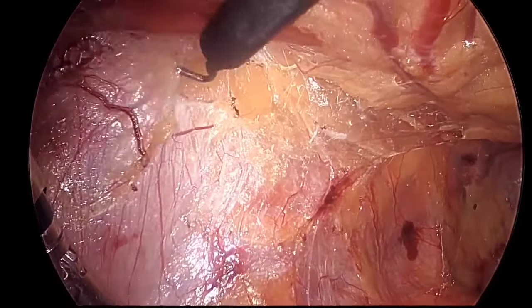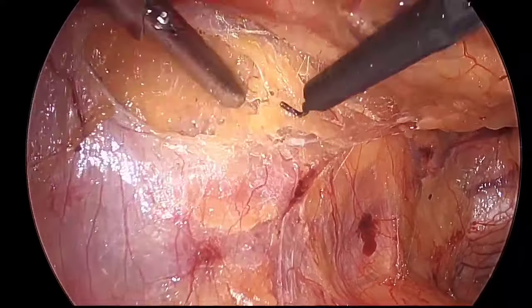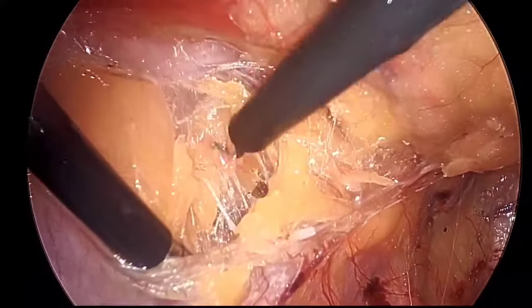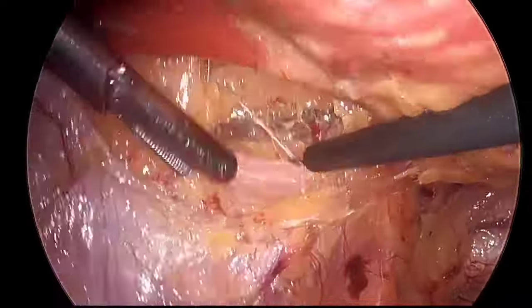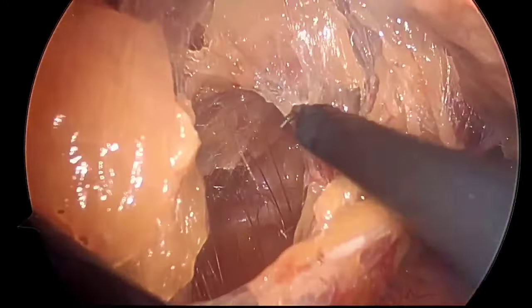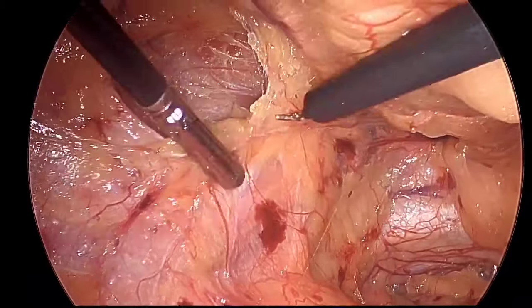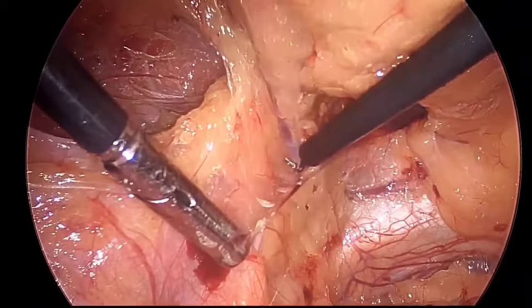And again on the left lateral aspect, I am dividing the posterior rectus sheath lower down so that I can get into the lateral space of Bogros on the left side. So here you can see the bringing down, pushing down the peritoneum. I'll be creating further space in the space of Bogros on the lateral aspect. Here you can see nicely the space is getting created, and further dissection towards the indirect defect area, I found there was a cord lipoma.